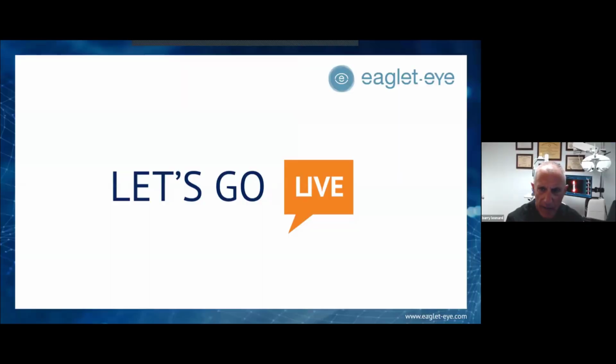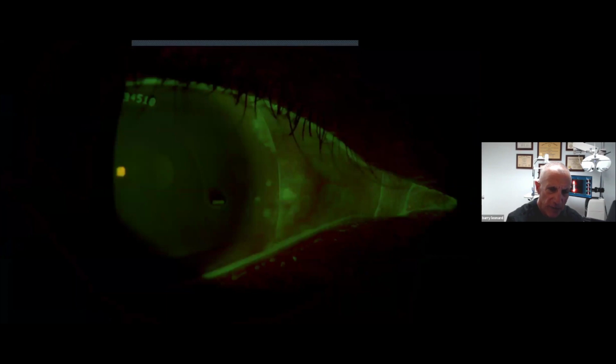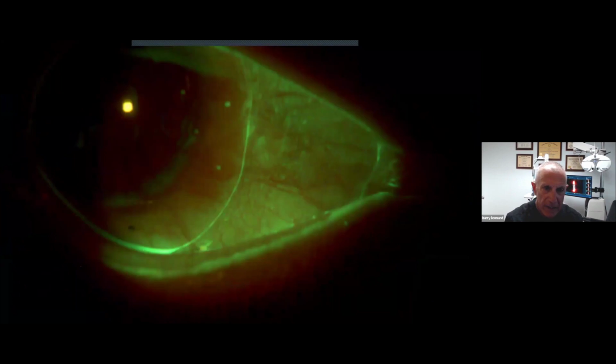And let's see, I think we can go back, and there's an example of a microvault. But here was the first microvault they made right there. It was just a little too small. It wasn't covering that whole area. So then I said, go back to that map, like we just showed you live, and measure it and make it as big as it should. And those three little dots are surrounding the microvault. You can see that's how big it should have been compared to that little one. So that's just part of the learning process that we do.